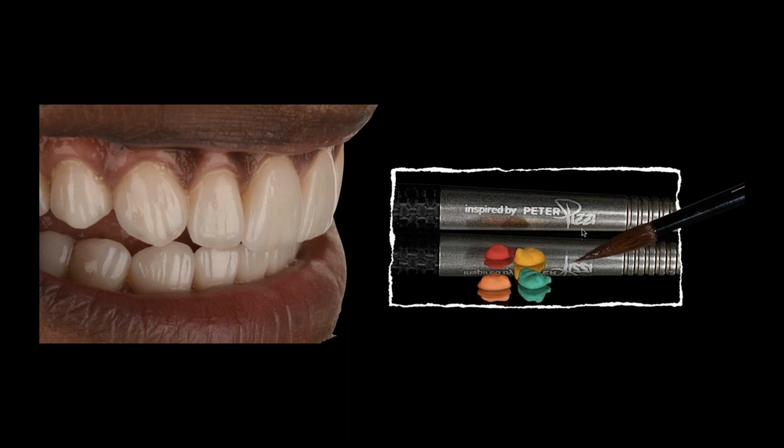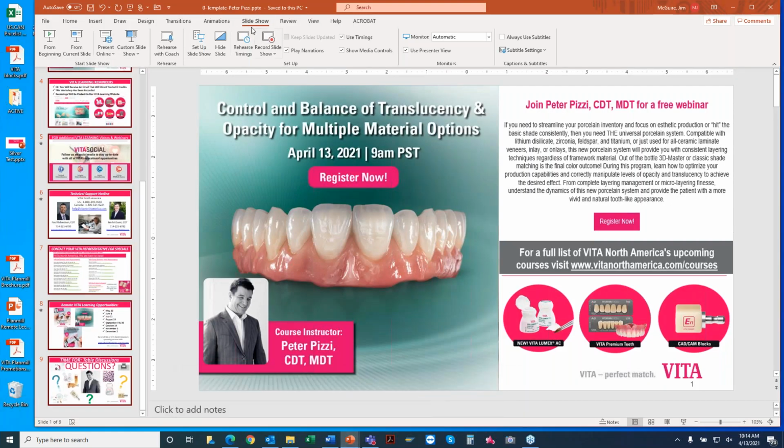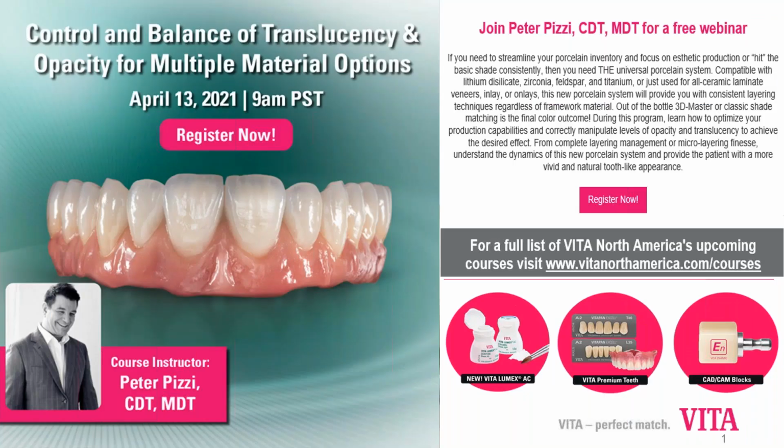If I'm doing metal ceramic crowns, I always use a violet around the halo of the coping itself, or the tip of that coping. And that's really just to hide the transition and stop that halo effect or that white headlight effect that you get. If I'm working with zirconia or lithium silicate, I do the same thing. I may do it slightly differently. In the opaques, I use violet opaque, which comes with my opaque kit. Some of them have it. If not, I might take it from a different kit. It doesn't matter. In the zirconias, I probably would do that with staining materials more than anything else, although I do have liners that can kind of handle that too.